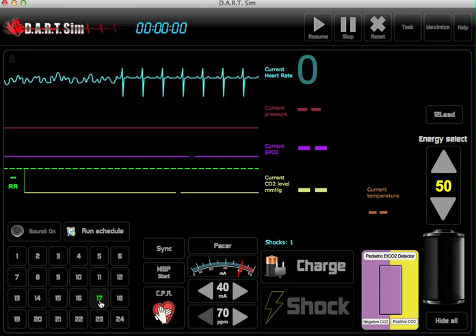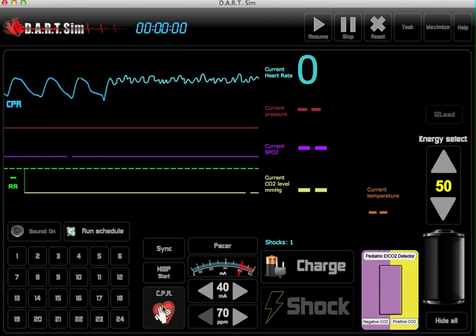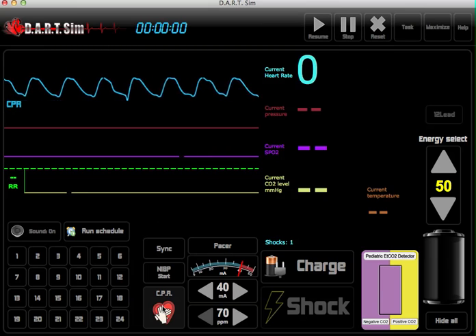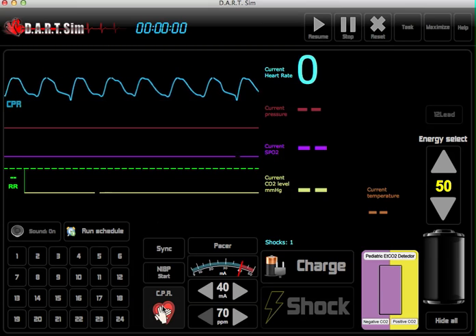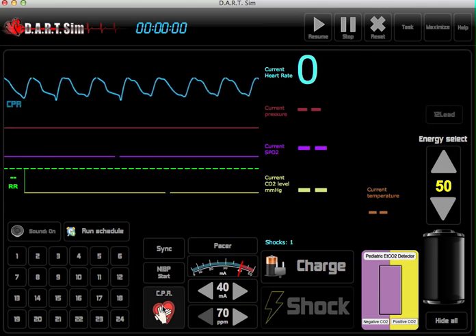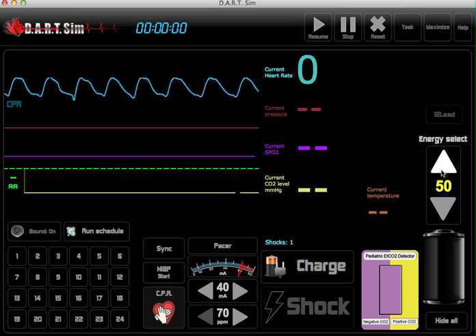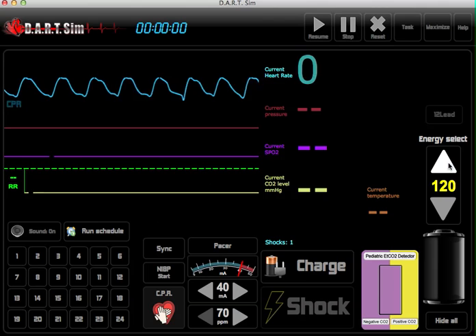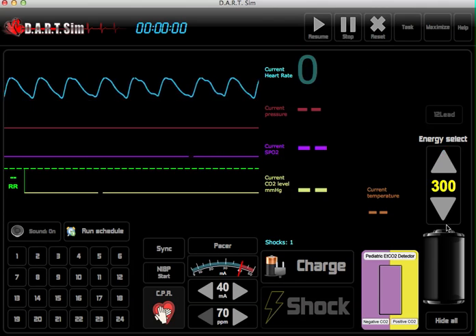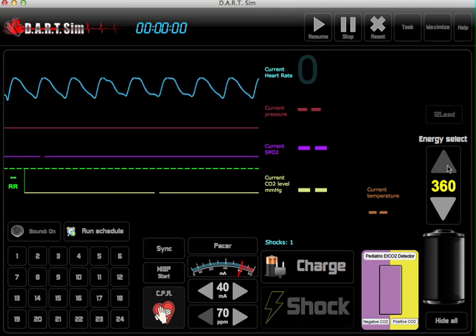And if your patient goes into V-fib, you can start CPR. We've got a CPR metronome that goes at a rate of 100 compressions per minute so the student can compress at the appropriate rate. While CPR is in progress, we can then charge the defibrillator to the appropriate joules — you can default at 150 or 200 joules, 170 up to 360.